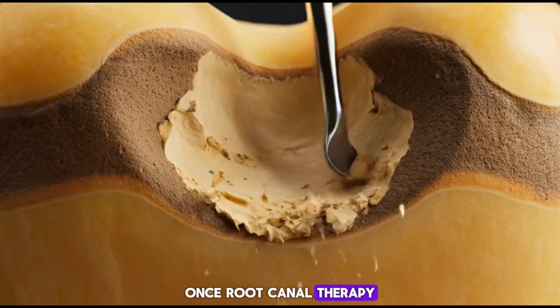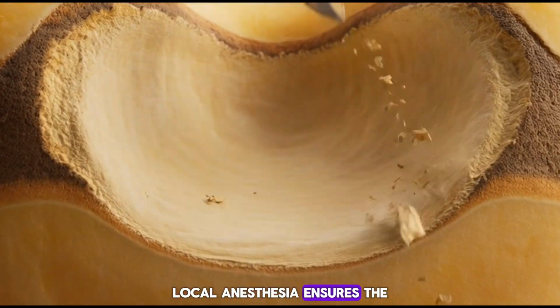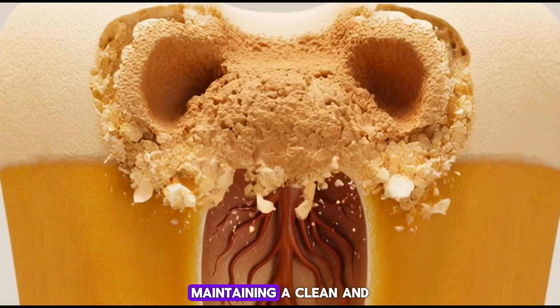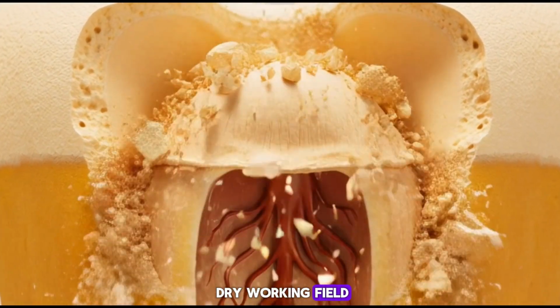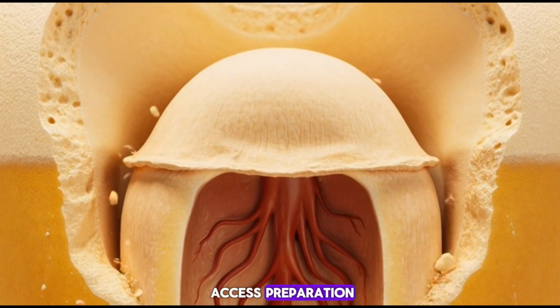Once root canal therapy is recommended, the patient is positioned comfortably. Local anesthesia ensures the procedure is pain-free. A rubber dam isolates the tooth, maintaining a clean and dry working field. Under magnification and focused lighting, the dentist begins the access preparation.